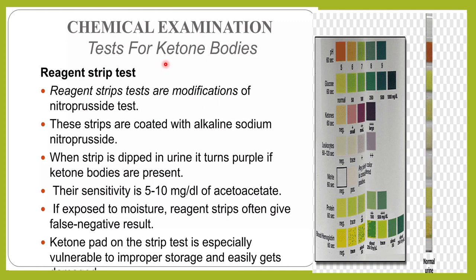Next comes the reagent strip test. The reagent strip test is a very commonly done test in the laboratory. So what happens in this reagent strip test? See, these reagent strips are just a modification of the nitroprusside test that we saw in Rothera's test.